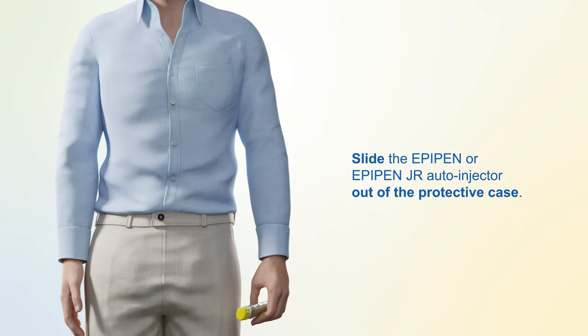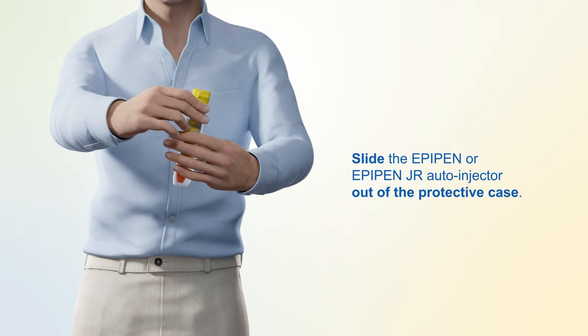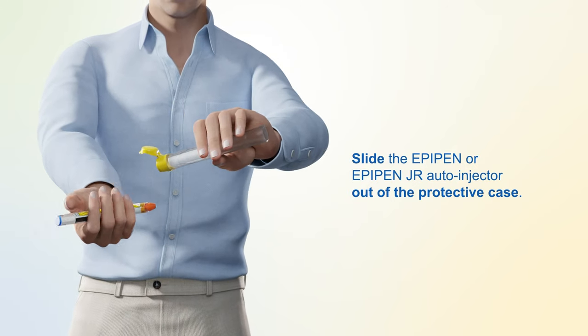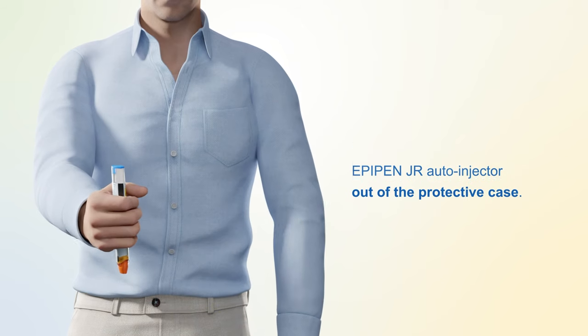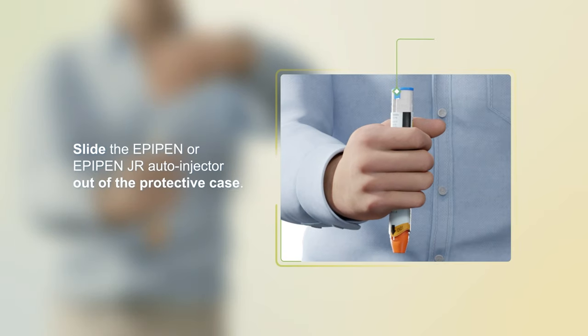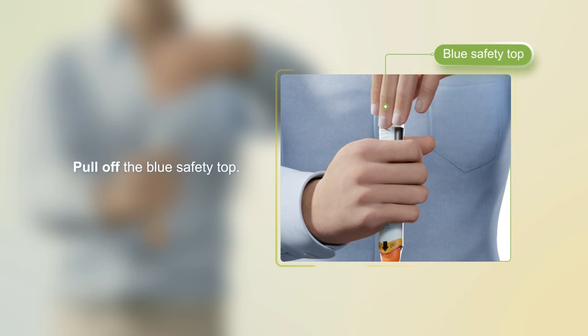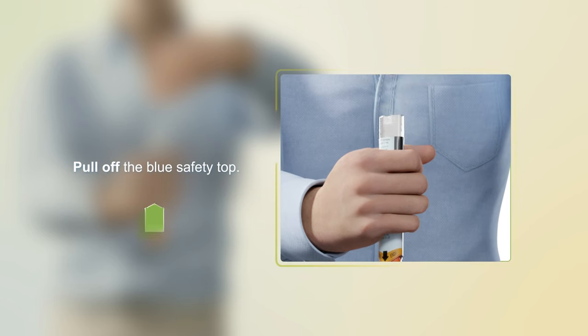Slide the EpiPen or EpiPen Jr. auto-injector out of the protective case. Pull off the blue safety top. Grip the auto-injector with one hand with the orange needle end pointing down. Use the other hand to remove the blue safety top — pull it straight up and away.